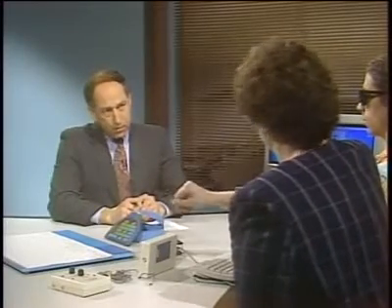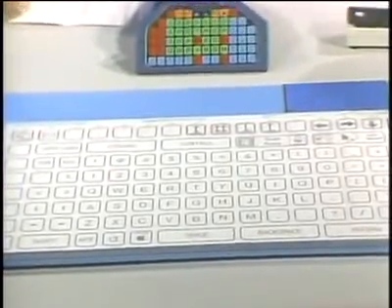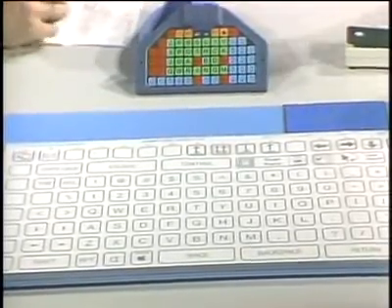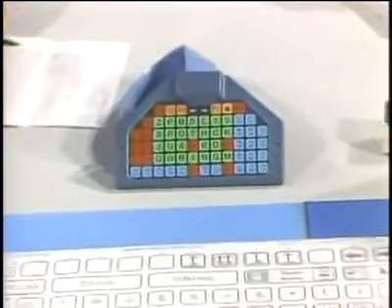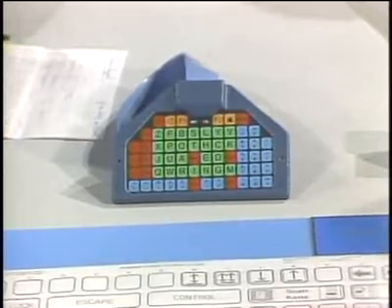Paula, you have some input devices here that are designed for use by the disabled. Just show us what these are and what they're meant for. Okay. This blue board is similar to the one that you've seen previously. It's used with people who have cerebral palsy who can use their fist to access the keys, or perhaps it's positioned down on the floor to be used with your foot. Okay, and this one? This multicolored small mini keyboard is used for people with muscular dystrophy. They have fine motor movement but don't have the full range to cover the entire keyboard.